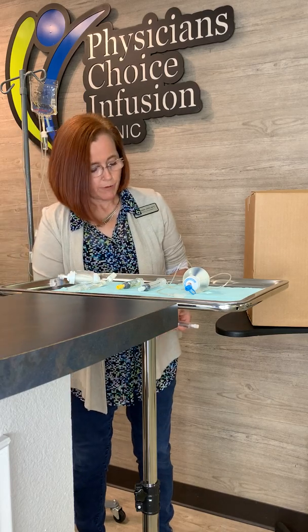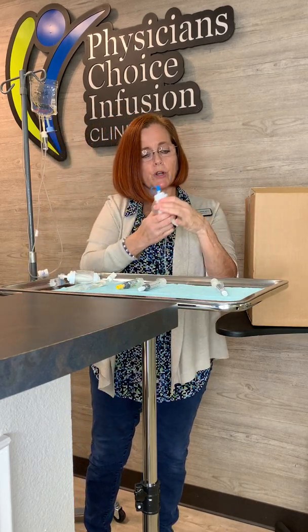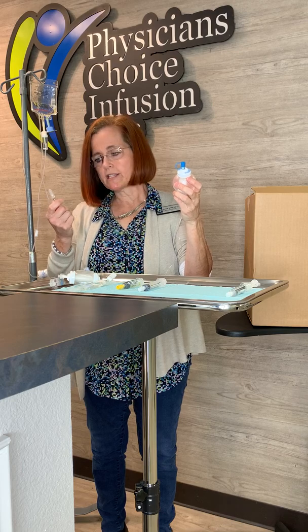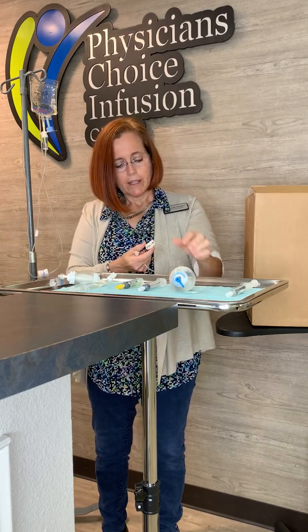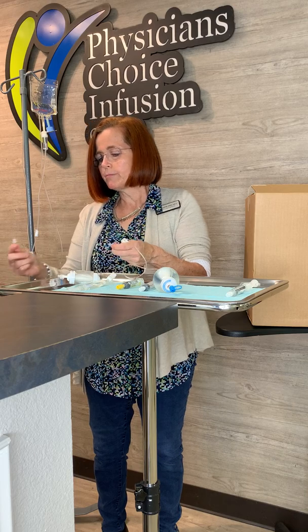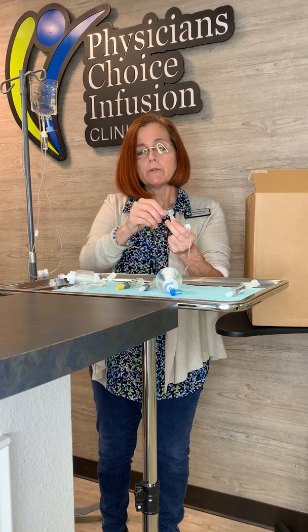You also want to prepare your IV elastomeric device by making sure it's primed. Primed means there's fluid all the way through the line. They come from the pharmacy primed already, but we do a little double check — make sure you don't see any air bubbles in your line. There's a clamp on here. Open up the clamp, remove the end, and let a little drip of fluid come to the top, then turn it off and recap it. If you touch the end of the cap to anything, you contaminate it — wipe it with alcohol.